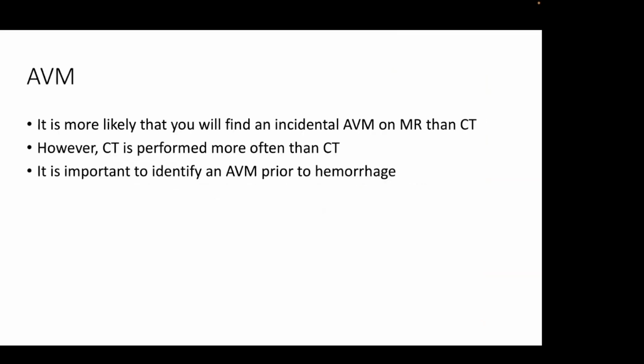So I'm going to change gears here and talk a little bit about the imaging of arteriovenous malformations.